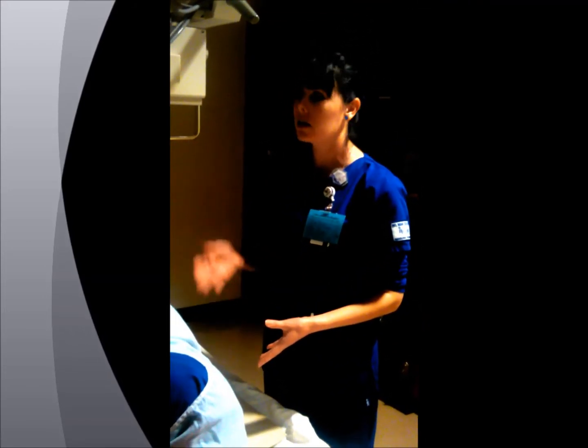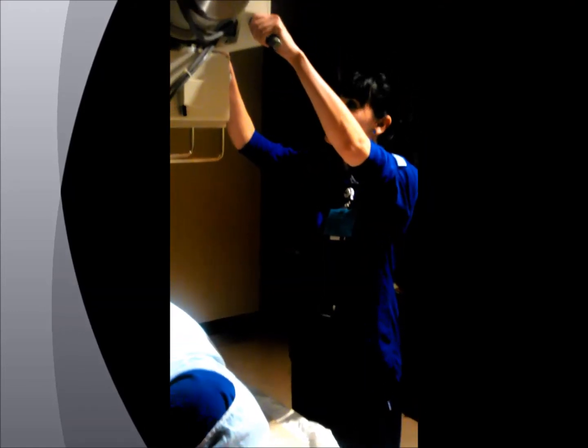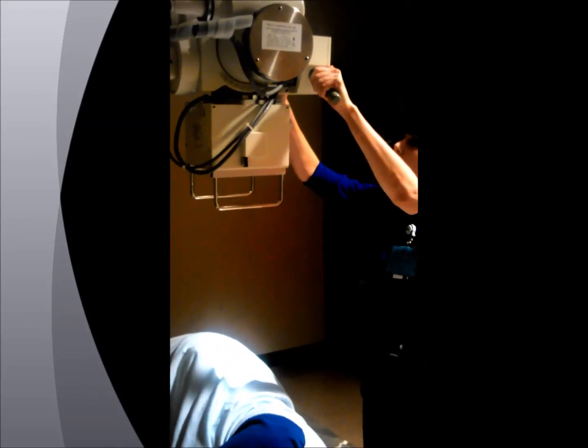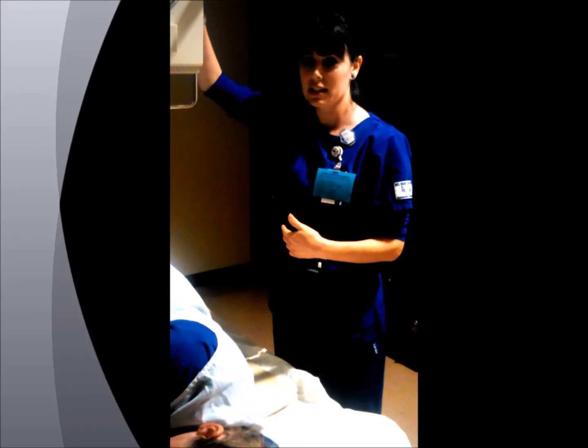We're going to use an angle for this. You may or may not, depending on how well the waist is supported. But since we want that L5-S1 joint open, I'm going to go ahead and use a 5-degree angle. You can use 5 to 8 degrees, so we're going to angle it towards her feet. For this, you're going to aim your CR 1.5 inches below the crest and 2 inches posterior to the ASIS.